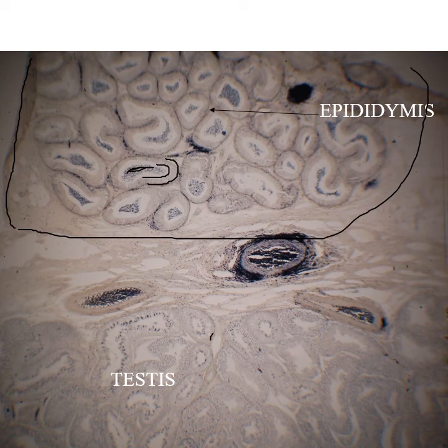Down here, if you look at the bottom, this is seminiferous tubule. The outer surface of the tube, when it's sectioned, is pretty well defined. This inner surface, it's just kind of ragged looking. I'm going a little too spastic with the mouse. But that's because the sperm are produced and they're just kind of being sloughed off and released into the middle. It doesn't have a sharp edge to it. That's one of the easy ways to tell.